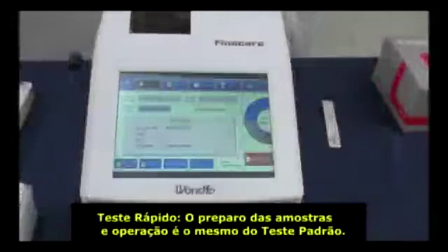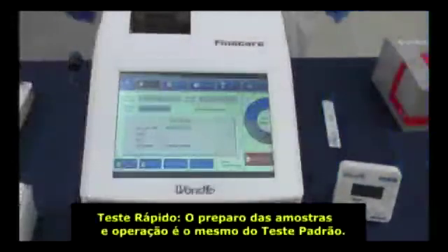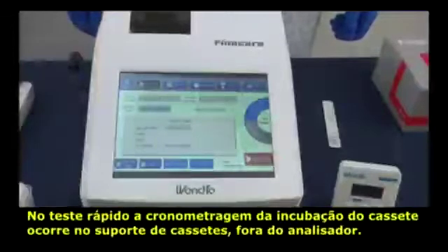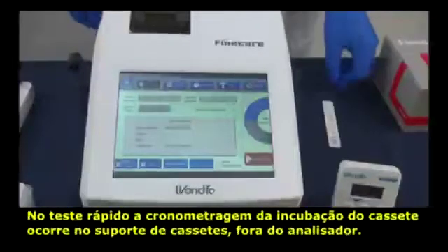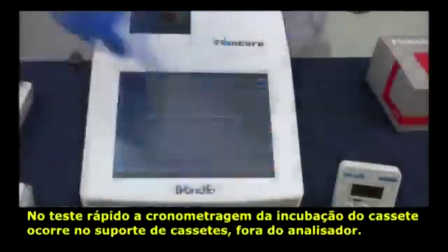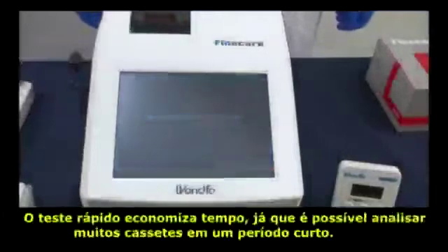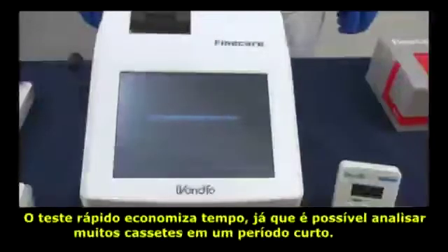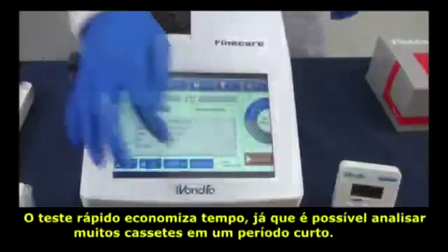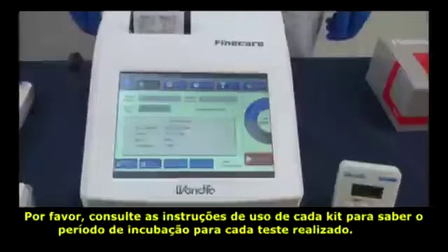Quick test. Preparations and operations before the loading step are the same as for standard tests. Notice: number one, in quick mode, please remember to use the timer as incubation occurs outside the device. Number two, quick mode saves time by overlapping reaction times so that it can provide multiple results in a short period. Number three, please refer to the instructions for the reaction time of each test item.